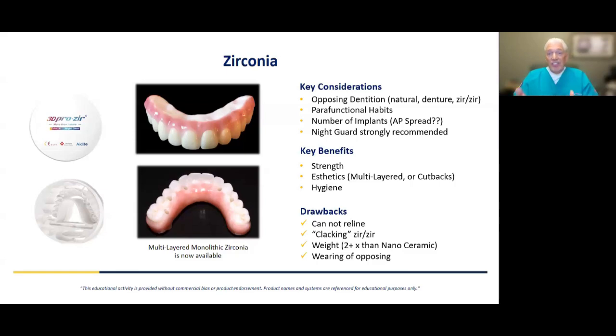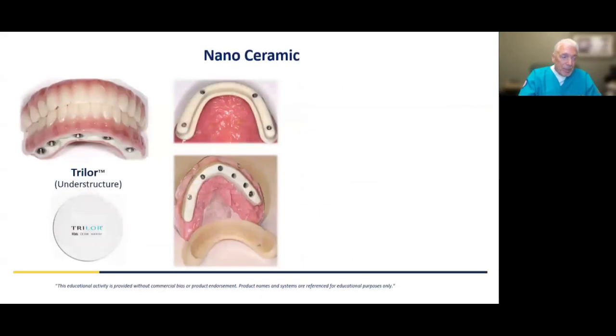Is that significant? Maybe on the lower for a small, petite, elderly person, and it's a large prosthesis. They're pretty heavy. I'm not saying you wouldn't do zirconia because of that. I'm just bringing it up as something to think about. And again, wearing the opposing.